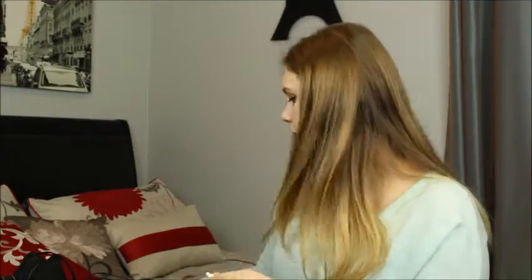Now the Ameda breast pump came with two tubes like this. They connect to a little plastic clip, I guess. And what you do is it connects just like that. And then this part connects into the base of your pump. Very easy. Now me, once I've plugged it in, I honestly never unplugged it. Once it's plugged in, it is good to go. And this part goes into the bottle, or into this right here, the top part. And you're good to go. You are good to pump. You're set up. So this is what it looks like with one bottle connected.